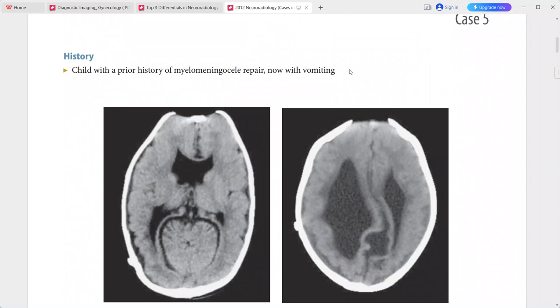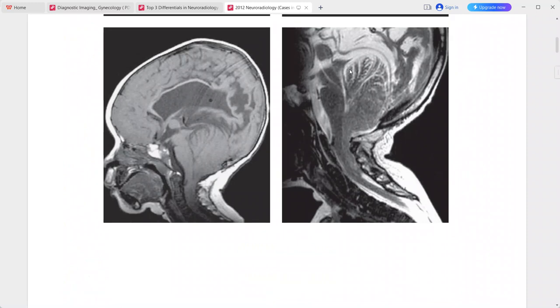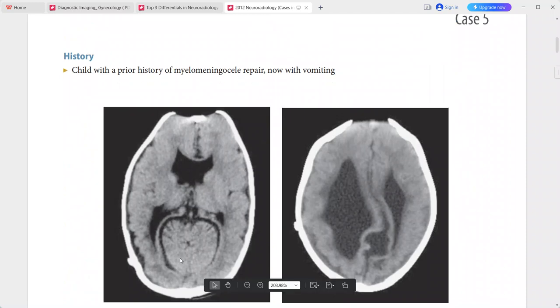Next case: a child with a prior history of myelomeningocele repair presenting with vomiting. This is a case of Chiari 2 malformation. CT images show a towering cerebellum through a gaping tentorial incisura, and absence of the septum pellucidum.